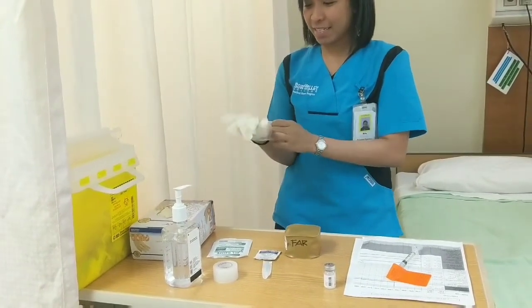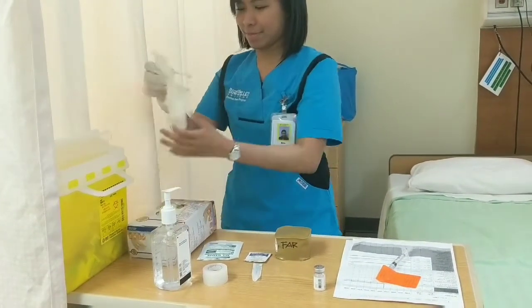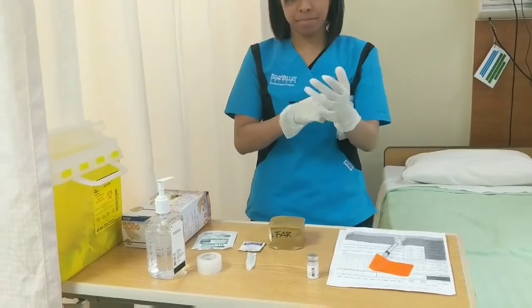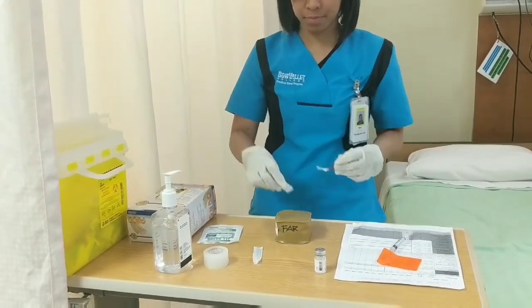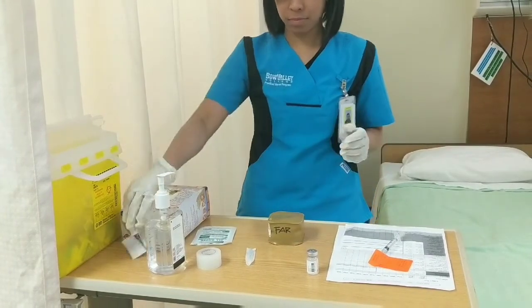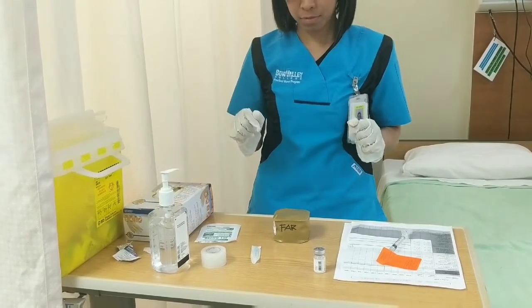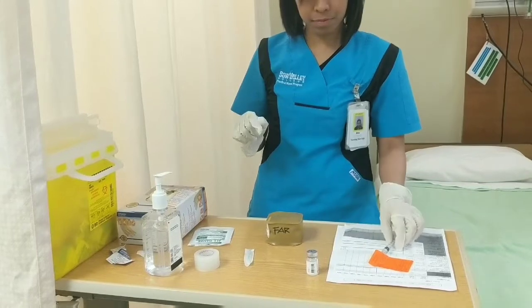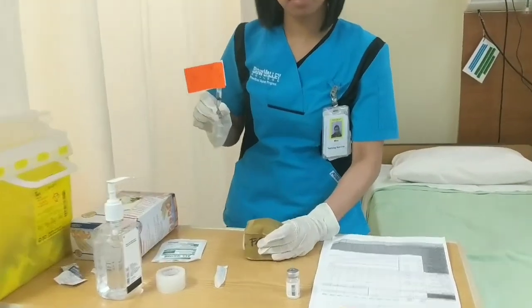Clean it in a circular motion for at least 30 seconds and let it air dry. Before injecting the medication, warn the patient and distract them by telling them to wiggle their toes. The angle of injection is between 45 to 90 degrees, depending on the subcutaneous fat and the needle size.